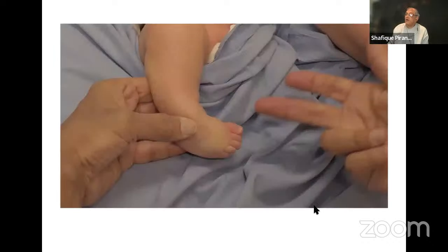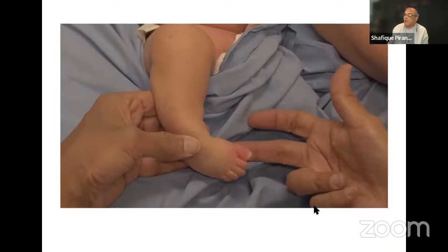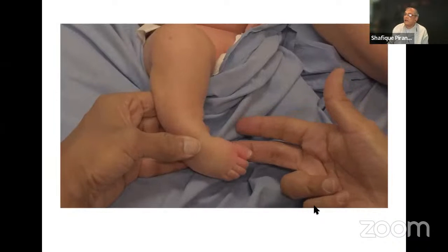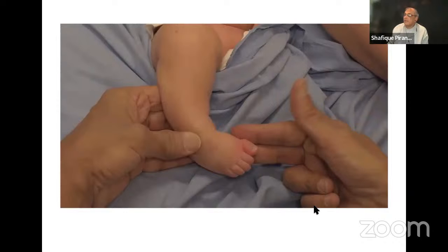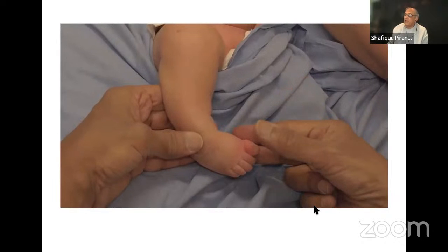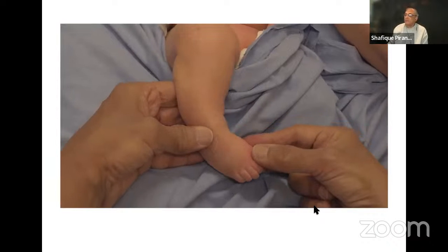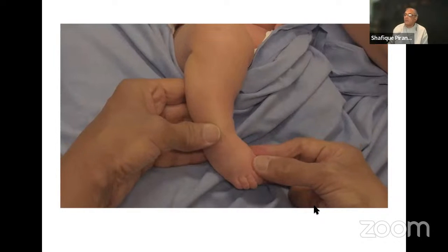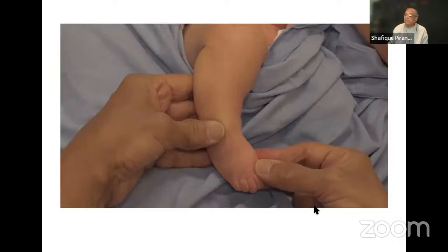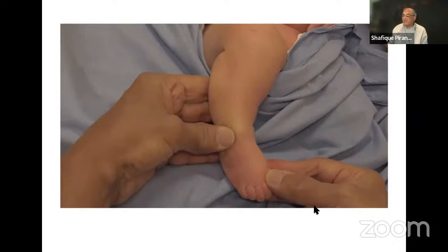So here's a video of the manipulating technique. So here's my long finger supinating the foot with counter pressure on the head of the talus. The thumb, the left thumb, is on the head of the talus. Now the index finger here comes on the medial side, and the thumb comes down on the top. Now I'm holding the foot like I showed you in the picture. And now I'm abducting the supinated foot. And in your mind's eye, you will be able to see that posteromedial retracting fibrosis stretch. And that's as far as I can take it.